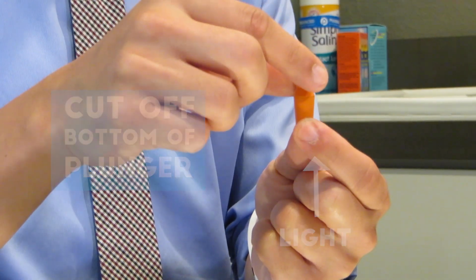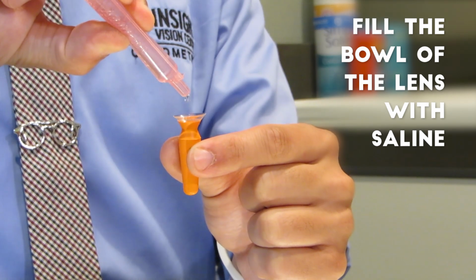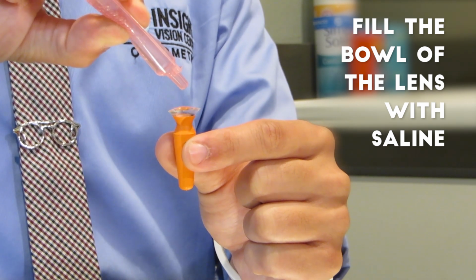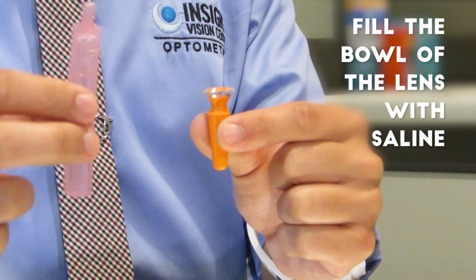Step 5. Fill the bowl of the lens with preservative-free sterile saline all the way up to the top. Be sure to remove any air bubbles that you see. Never use tap water to fill the lens, as tap water is not safe to put straight into the eye.